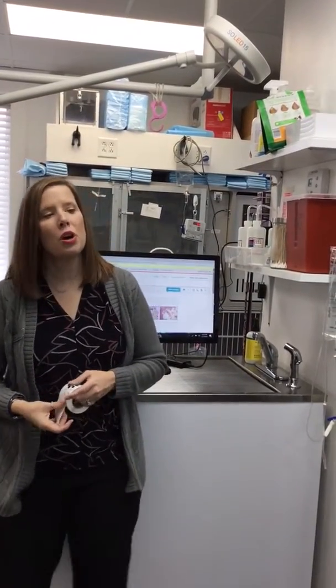Why is that though? That's a good question because there has been lots and lots of research. Even though we see that clot forming, the only difference between serum and plasma is the clotting factors. Even though it's a good looking clot, there are still clotting factors floating around in that solution that have not incorporated into the clot. So if you spin it down before 20 minutes in something you're running in-house, you're actually running plasma. Certain tests, like the CPL, are extremely sensitive to interfering substances, and those clotting factors are the interfering thing.